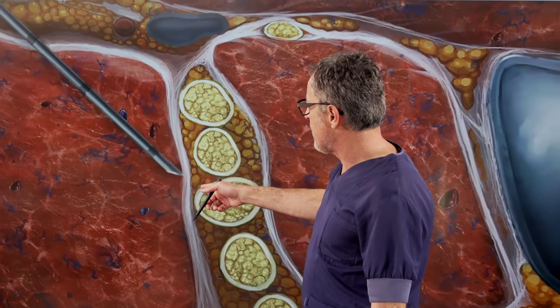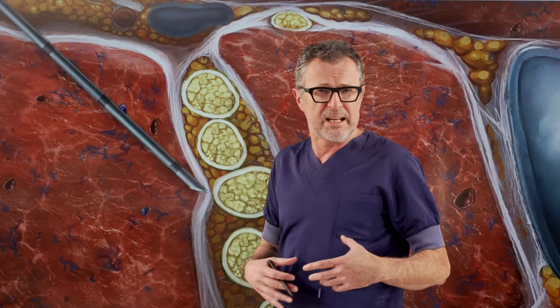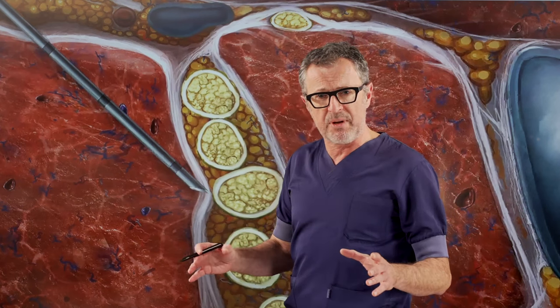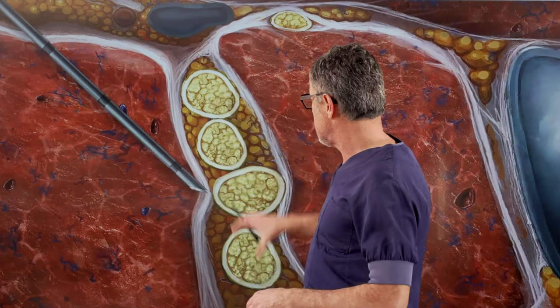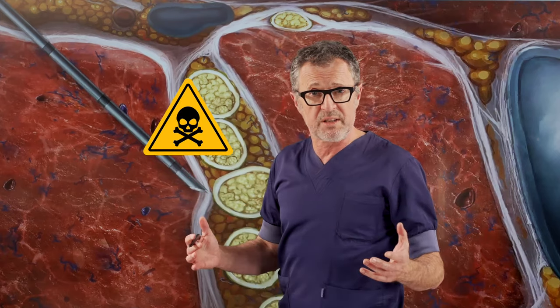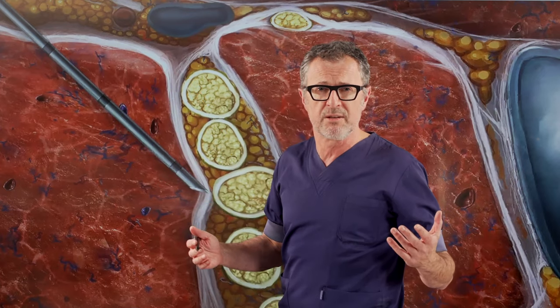As the needle now approaches the brachial plexus sheath, at some point in time, the sheath has to give. And when that happens, you can actually get a violent entry of the needle into the brachial plexus sheath with a resultant injury to one of the roots or nerves that we're trying to block.